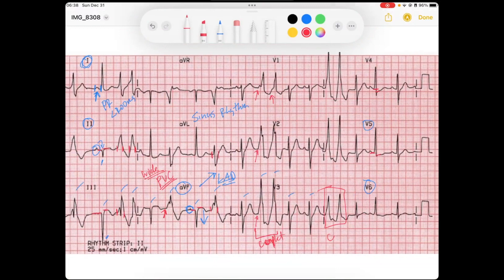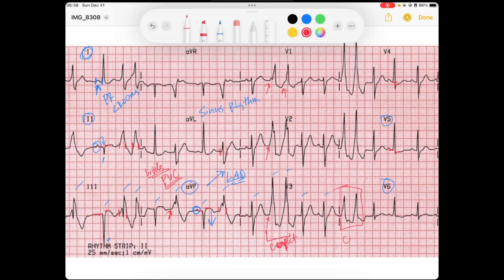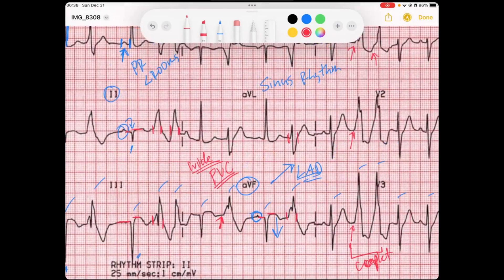Now looking even closer at these inferior leads that have the elevation, what are we starting to notice? We're starting to notice these deep Q waves — which in other words are pathological Q waves.